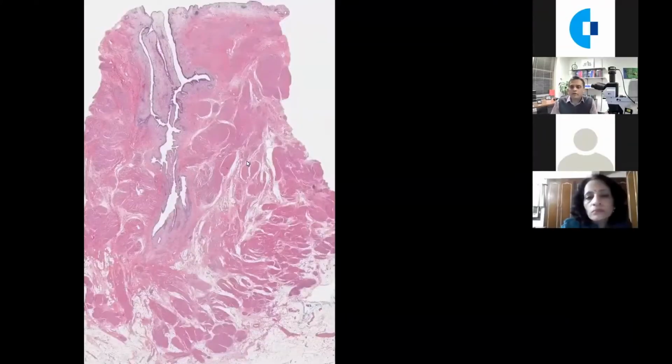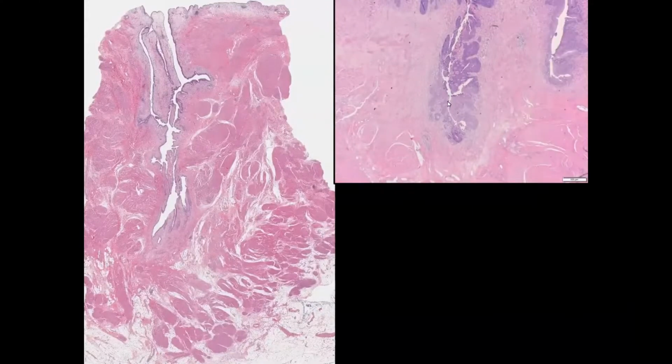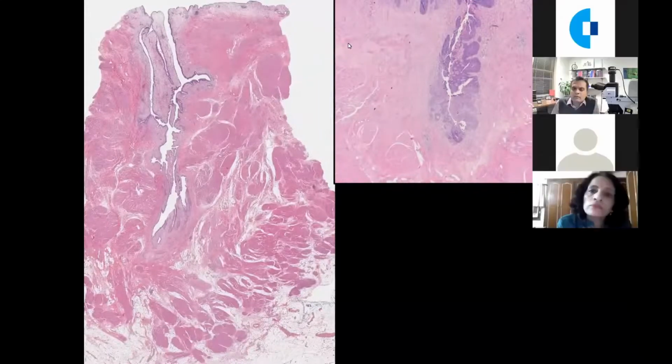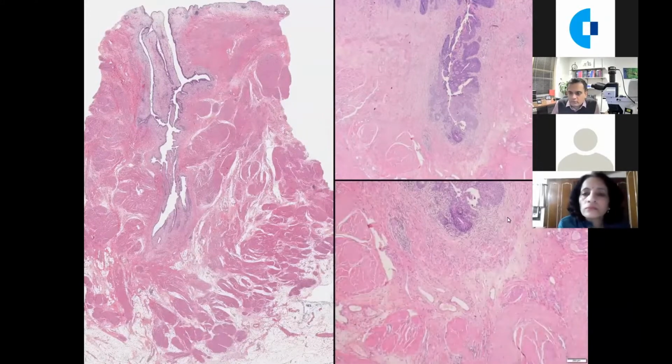So it's present throughout, right? Another example here where you can see this papillary urothelial carcinoma, which is involving the diverticular tract. But if you observe carefully, you can see a portion of muscularis mucosa, which is present in the lamina propria, is being dragged along with the diverticular tract to the deep muscle, right? In higher power, you can clearly see this. So this is superficial lamina propria, muscularis mucosa, deep lamina propria, so all the layers are still present. So we have to classify the invasion as it happens here and not just call it PT2.